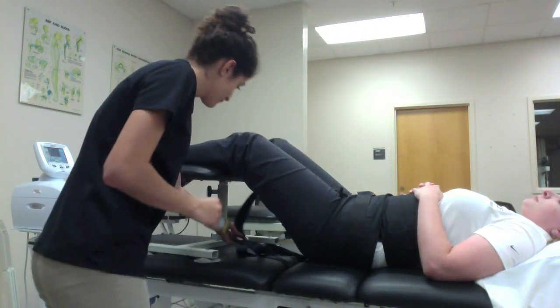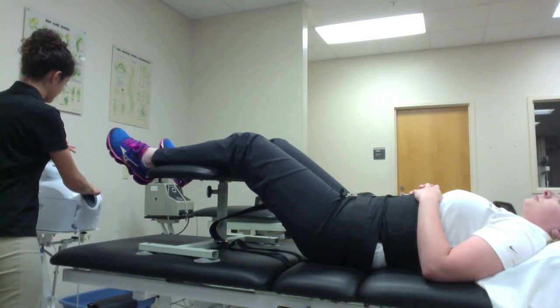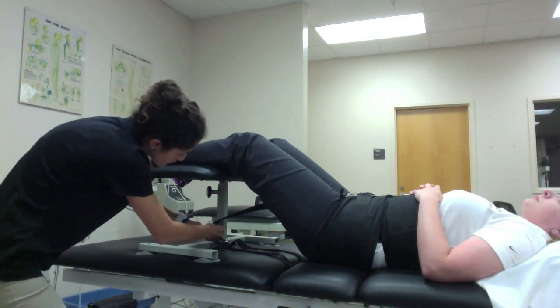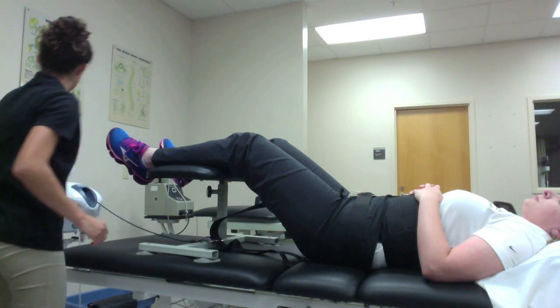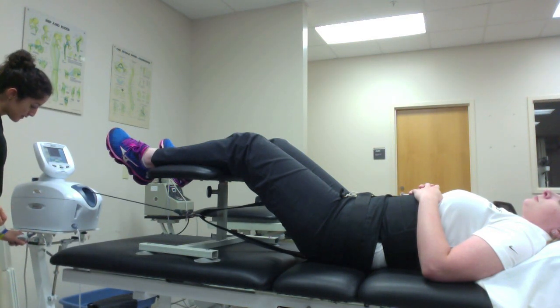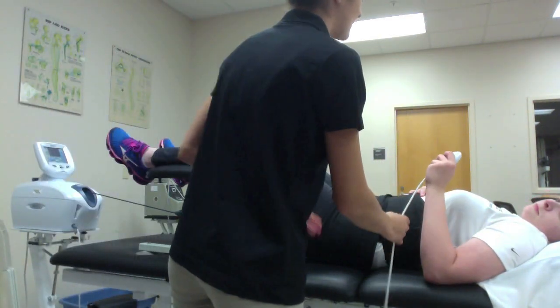Alright. Now I can release my rope. Now I make sure that this rope is nice and taut again, so I just press the spine. Prior to the treatment starting, I also want to hand my patient the call button to make sure that if anything goes wrong, she can stop the treatment.